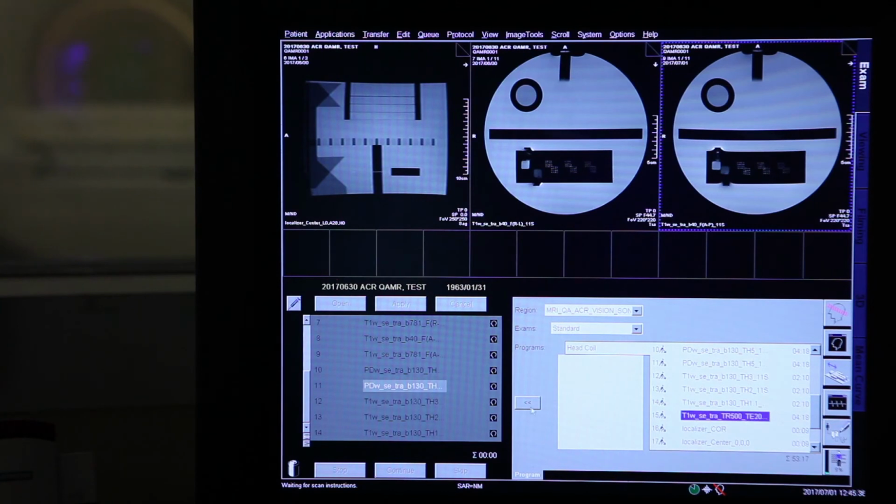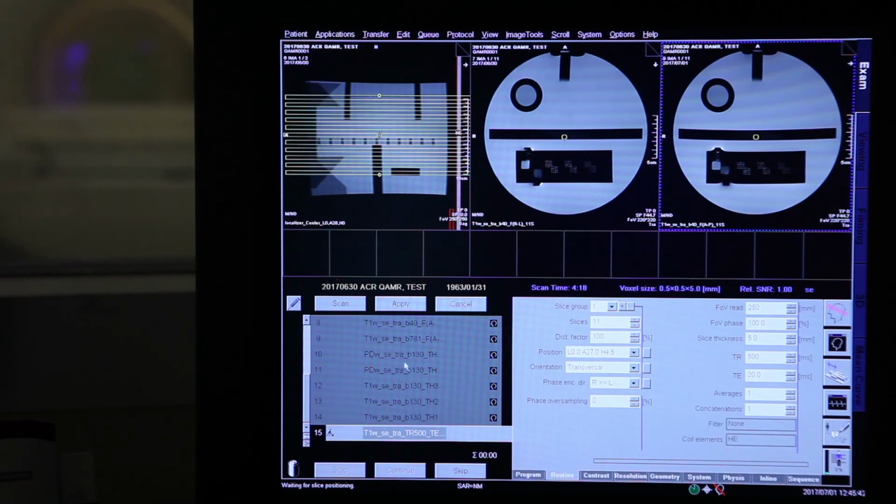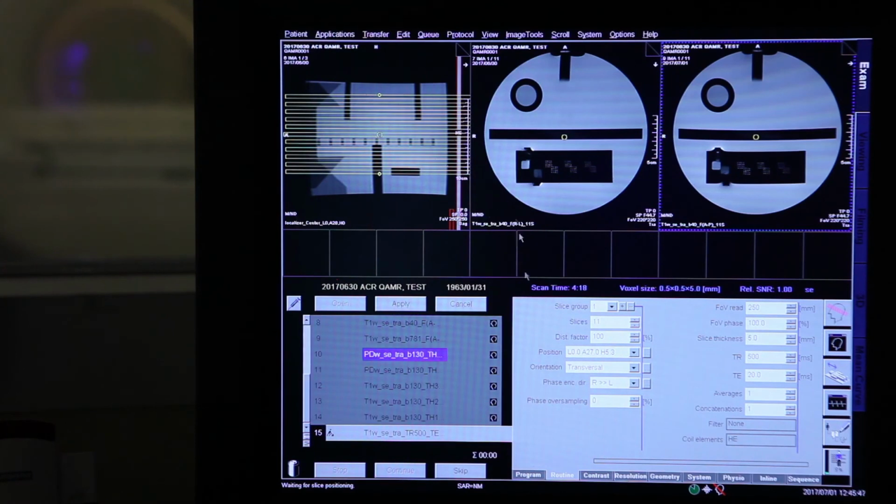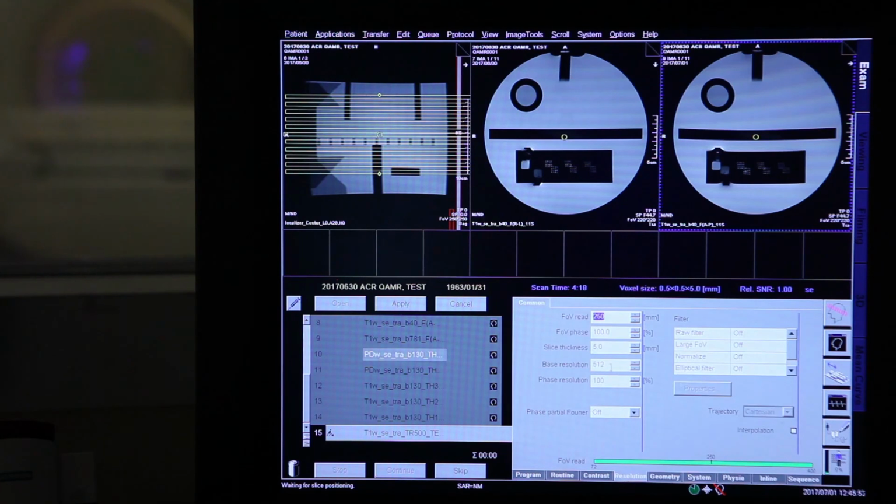Okay. I'll take this thing here. Again, we repeat the 11 slices. I'm taking something like here. All this T1 contrast. Use T1 only. Here, beware, we put a resolution of 512. And with this 512 resolution, of course, you expect the time to increase, it doubles the time, 4 minutes, but the pixel goes down to 0.5 by 0.5 millimeters. So I'm expecting to have a better spatial resolution and be able to see the dots here. You have to wait something like 4 minutes.